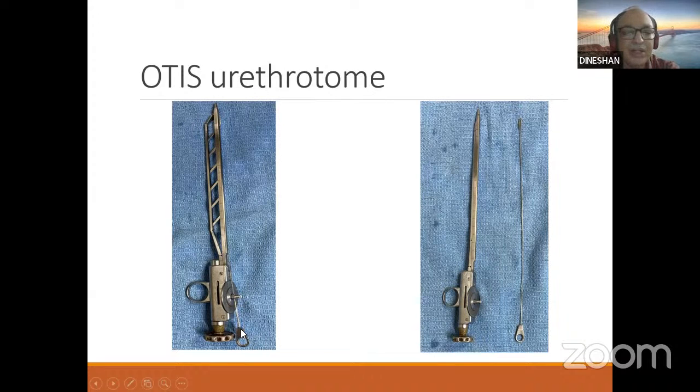And this is the blade, which you can introduce with the hand supporting, and once fully introduced, the blade will go into the groove. Once you introduce and dilate, pull the blade slightly out so that it comes out and stays like this. Once the urethra is stretched and the blade is out, and you take this out, only the stretched part of the mucosa will be cut. So there won't be any deeper injury, and that is the advantage of this instrument.